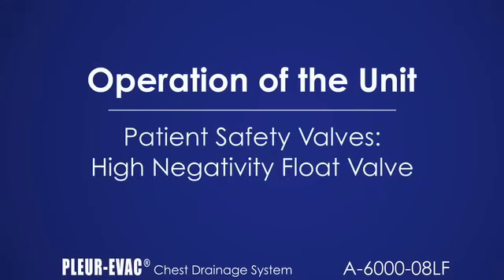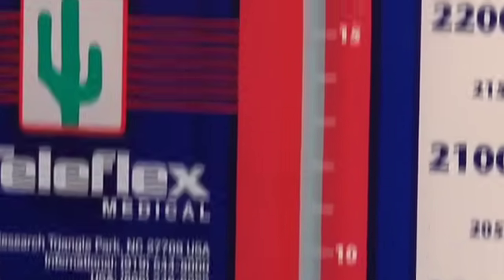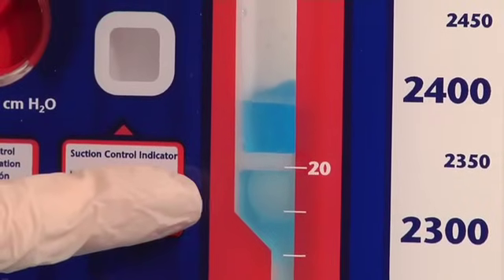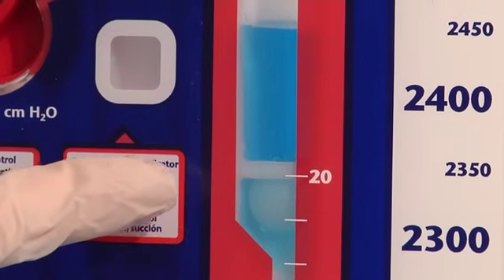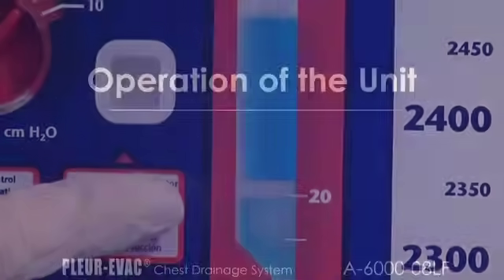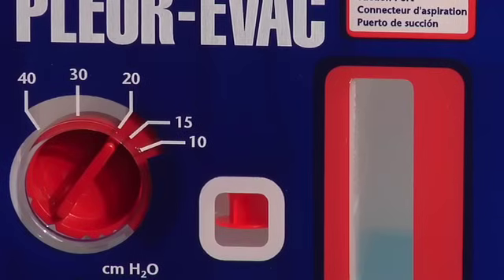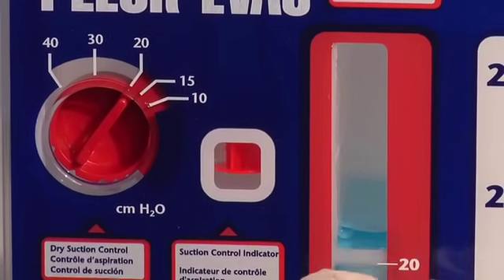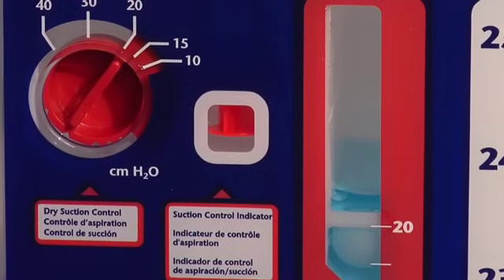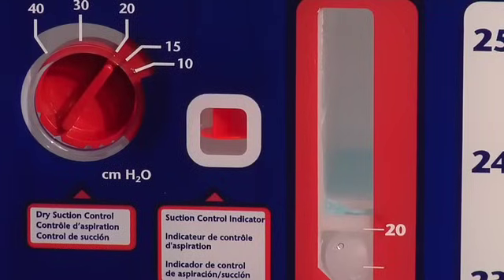The high negativity float valve automatically activates and preserves the water seal in the presence of high negative pressure. Water floats the valve into the closed position. The fluid level will also break at high levels above the float valve, limiting pressure buildup. The manual filtered high-negativity relief valve is provided to manually vent excessive negative pressure. Note the fluid level in the small arm of the seal, then depress the high negativity valve to vent negative pressure. Filtered air will enter the unit and the fluid level in the seal will drop. Release the button when the desired level of negativity is attained.